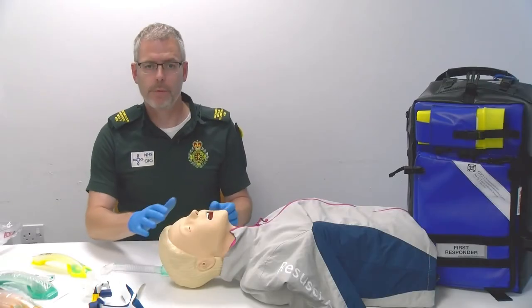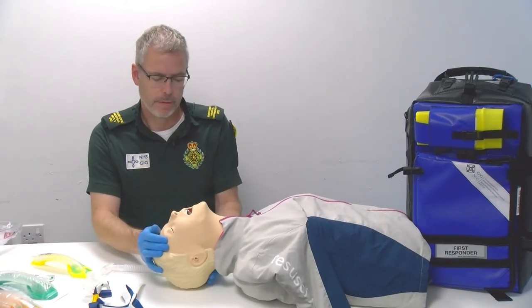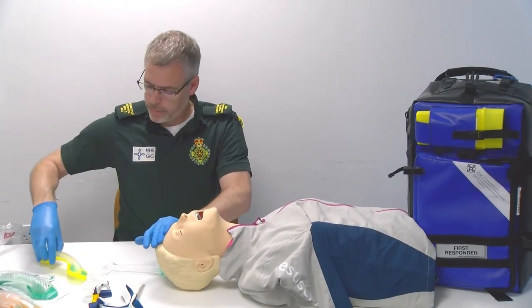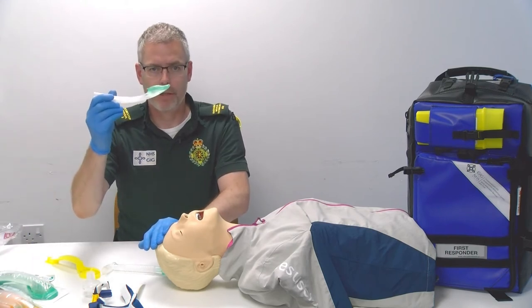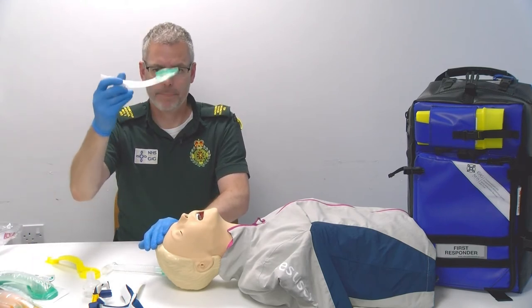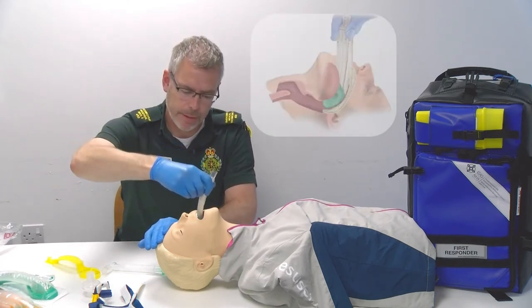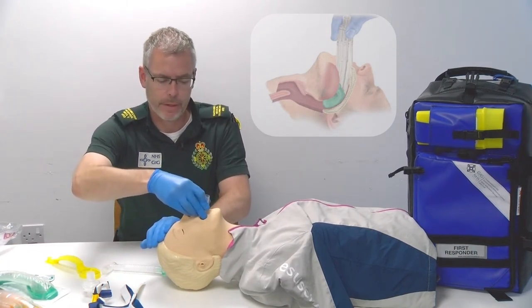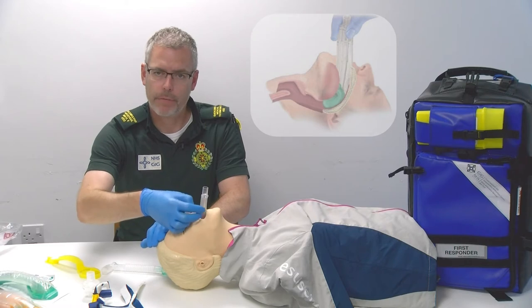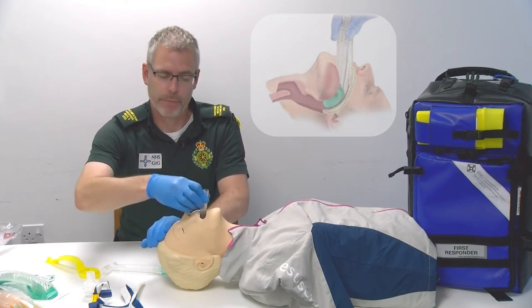We're going to apply a basic airway manoeuvre: head tilt, chin lift. Then we're going to grab the iGel that's already lubricated, hold it like a pen and place it into the airway in this direction, push down until there's resistance. There's a black line at the top of the iGel itself that needs to be in line with the teeth or the lips of the patient.